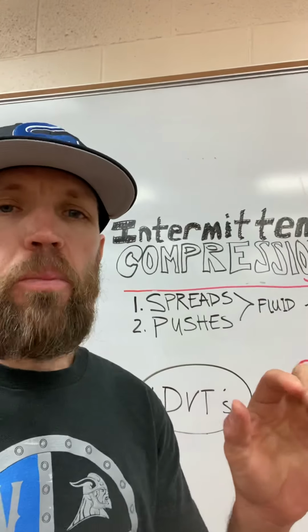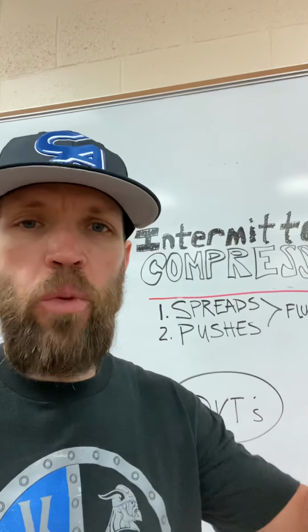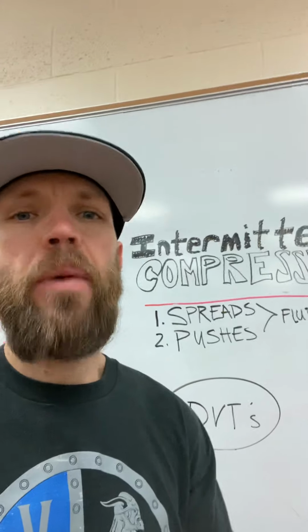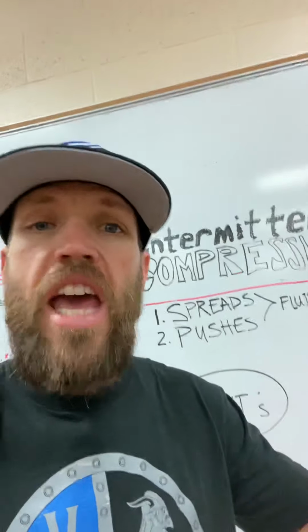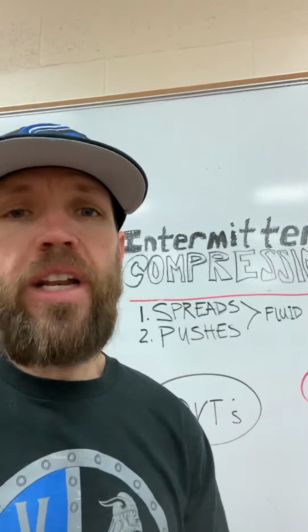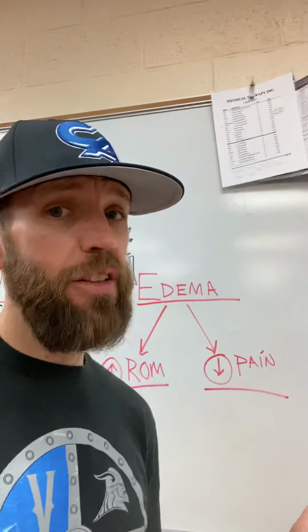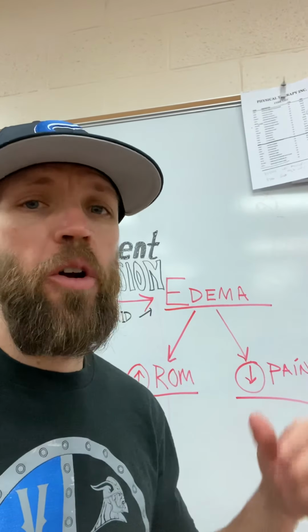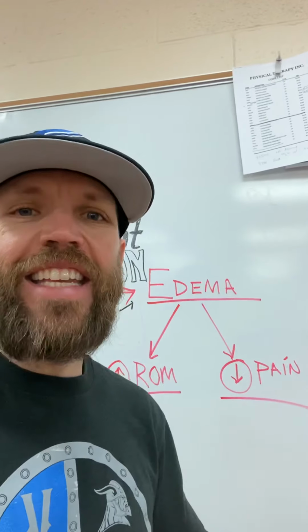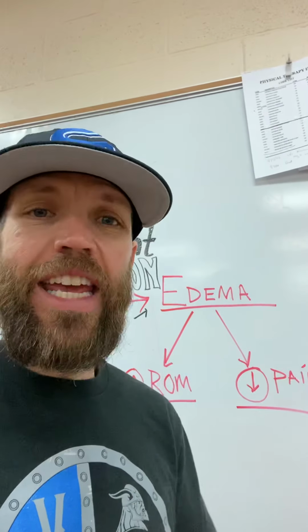And so when we put that device on our patient, what we're doing, therapists, is we're literally taking a mechanical device surrounding that circumferentially around a joint, and we are pushing fluid. And that fluid, what we really like to call it, because we want to sound smart, is edema. Fluid doesn't make us sound real smart, but edema does. And edema is a really critical component to get out so that healing can occur.